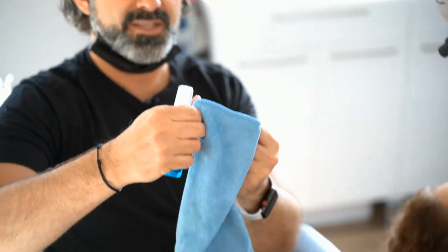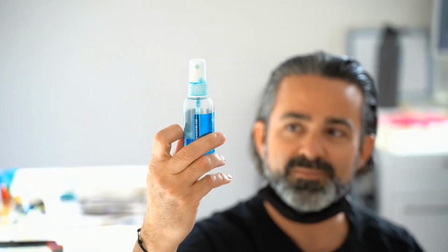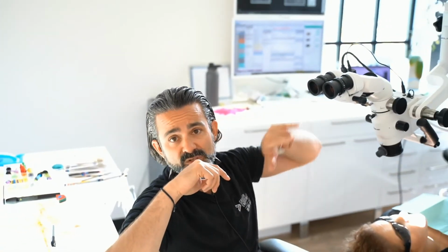That's great. The other option is you can always use microfiber towels and wash them. We have a lot of these floating around, and we use them and wash them. What I've learned to use is an anti-fog, anti-static cleaner. I don't want to sell brands, but it's really helpful for my wispy eyelashes that I keep cutting. And heat: if you run hot, Florina, when you use a lens cap your body temperature can actually fog it, just like my ski goggles, since I live in Utah. So I use an anti-static, anti-fog cleaner so these don't fog on me.